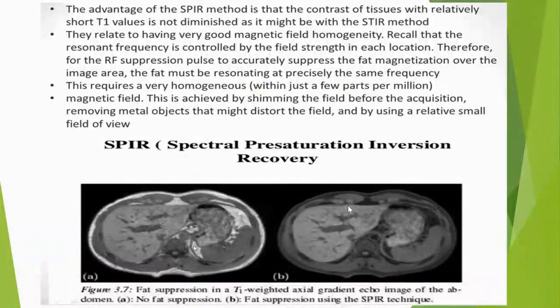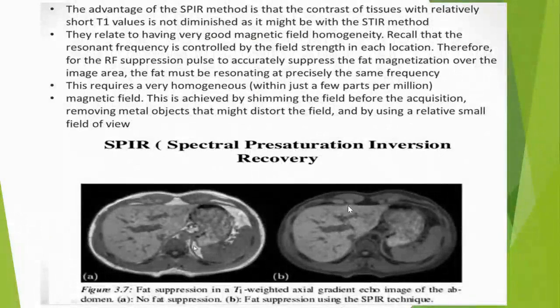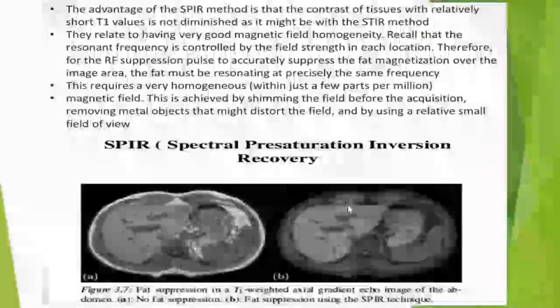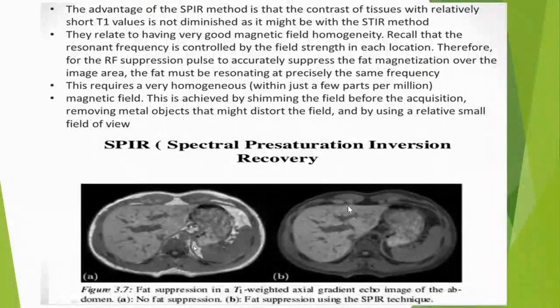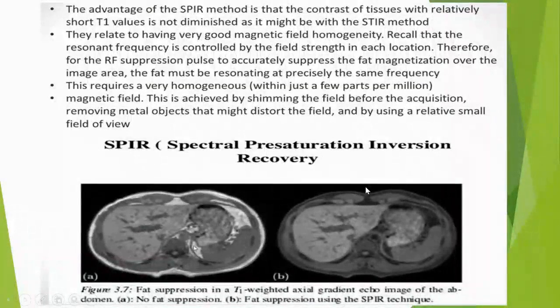What does this mean? It means that the number of protons you will work with inside the patient's body increases, allowing you to excite a larger number. The magnetic field at 1.5 Tesla does not stimulate the same number as at 3 Tesla or 7 Tesla, so the number will increase.